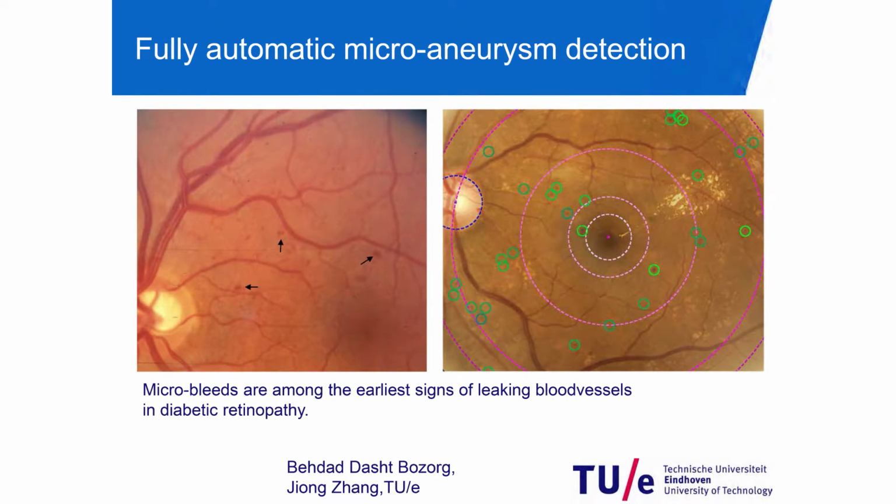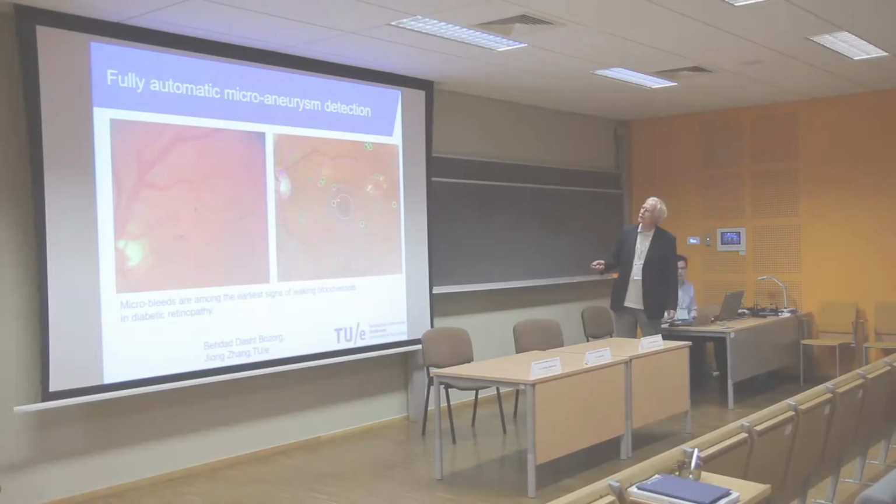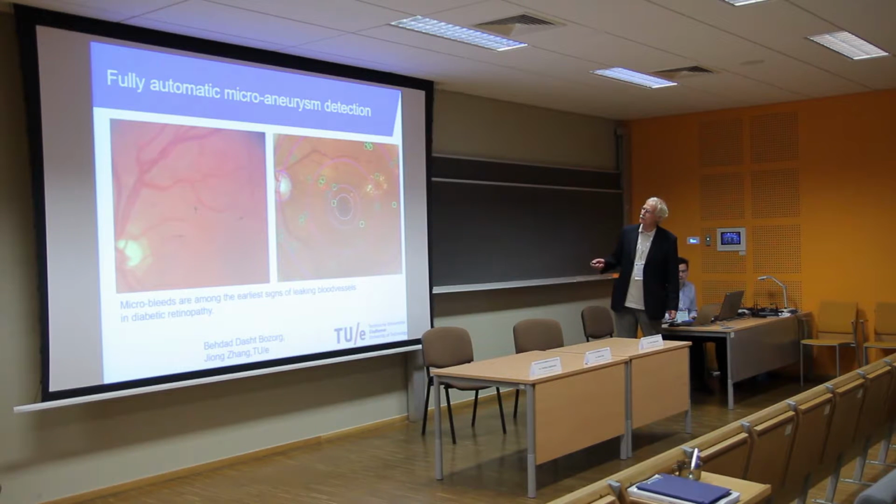We also developed techniques for automatic microaneurysm detection, and here you see the result. The brightness of the ring indicates the probability, assigned to the certainty that we find it.